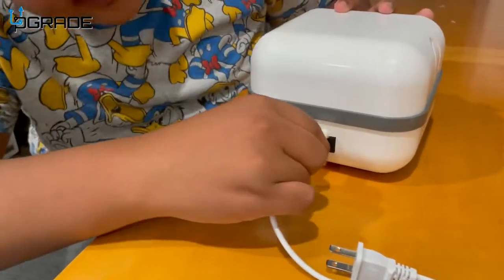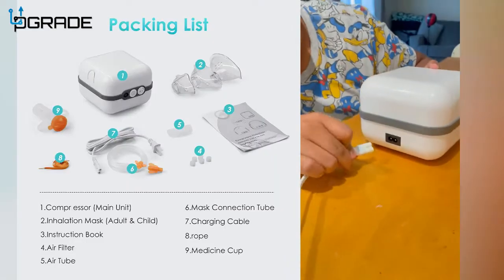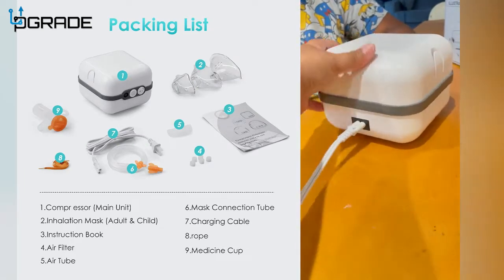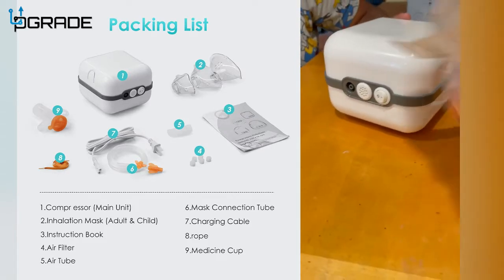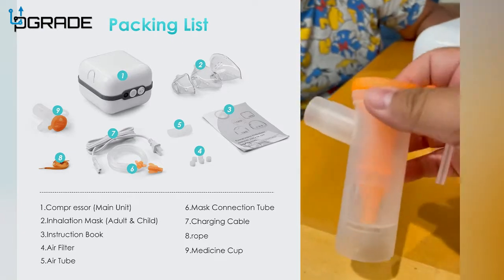This is the cord — it connects to the back and then you connect it to your wall outlet. It comes with a plug, so go ahead and plug it into your wall outlet. Up front you also have the medicine dispenser — you can see the inside of it right here.